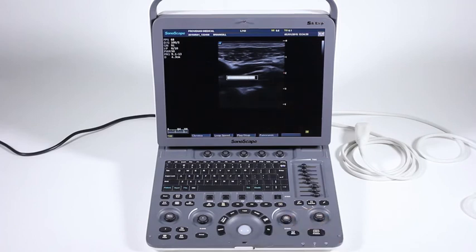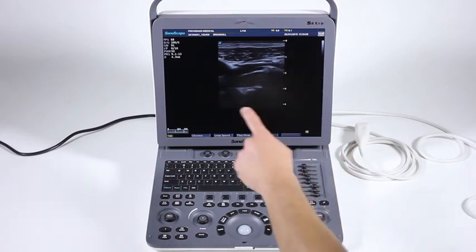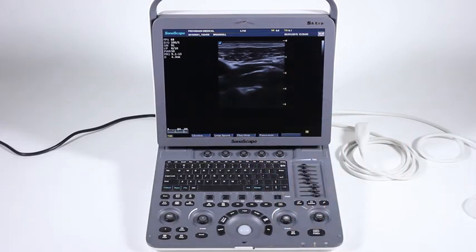Sometimes you have to press that twice, particularly in color Doppler, pulse wave Doppler. In some situations, if you press and hold it, you notice it won't save. And this may be changed in a later version, but at this time, with this particular version, occasionally you'll find you need to press and hold it twice. Make sure you see that progress bar and hear that sound before you're sure that it is saved to the hard drive.